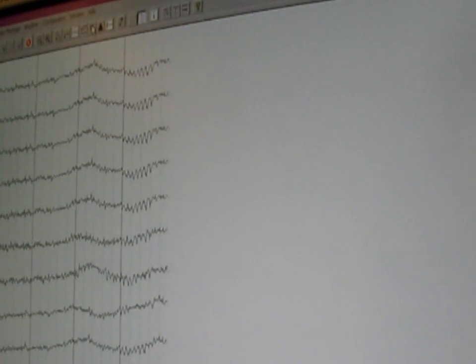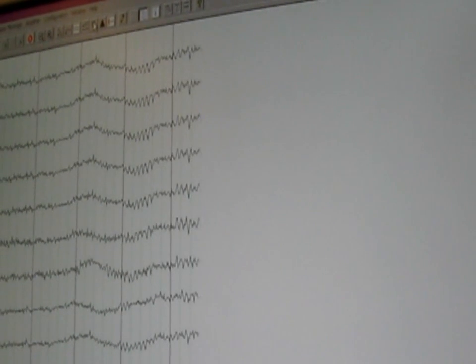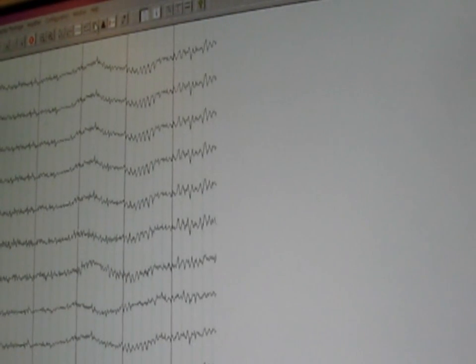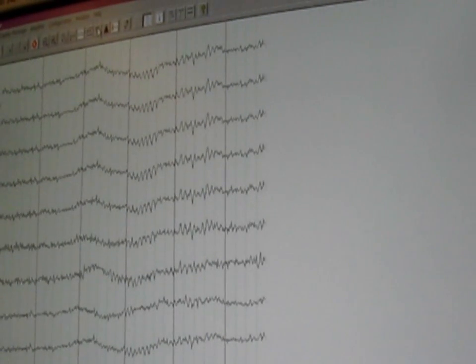Let's look at it again. Here you can see the beta activity of an active mind because I'm actively visualizing the stuff on screen. There you can see the alpha activity coming up, these slower and of greater amplitude waves.